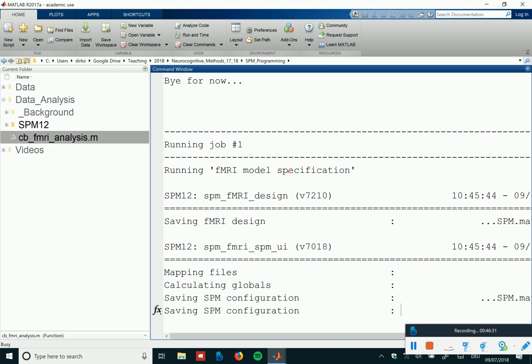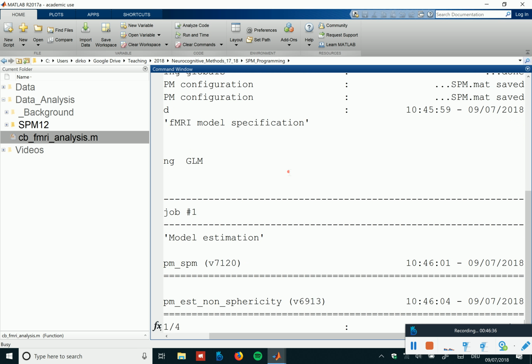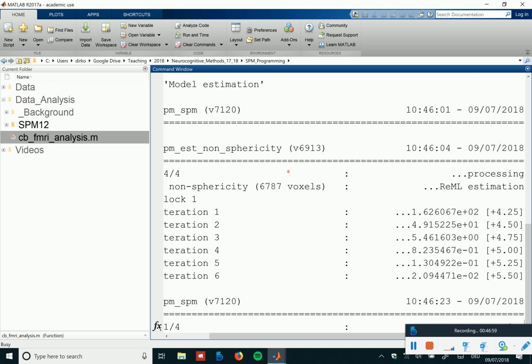And that's GLM analysis of fMRI data. And then it's over. I'm just estimating it again for the fun of it. And then, of course, what one usually does is that one doesn't analyze only a single session, but multiple sessions, usually with a block diagonal design matrix, so parameters for each session, which then by means of contrasts are collapsed over sessions.